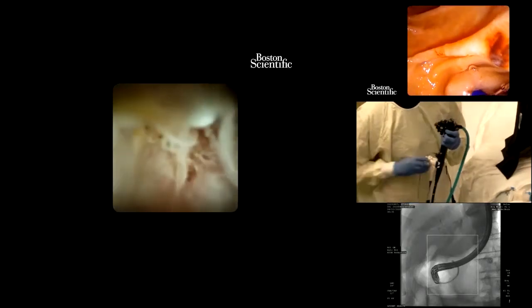One of the questions is whether we always use ROSE for these cases. That's a good question. We are very blessed with a very good cytopathology department, particularly a very good cytotechnician. So it's our natural preference that when we have access to it, we do it. But as I have shown you, our study tells you that if you don't have a pathologist and you perform three biopsies, your sensitivity will be more than 90%. But then the quality of the biopsy that you obtain is very important.